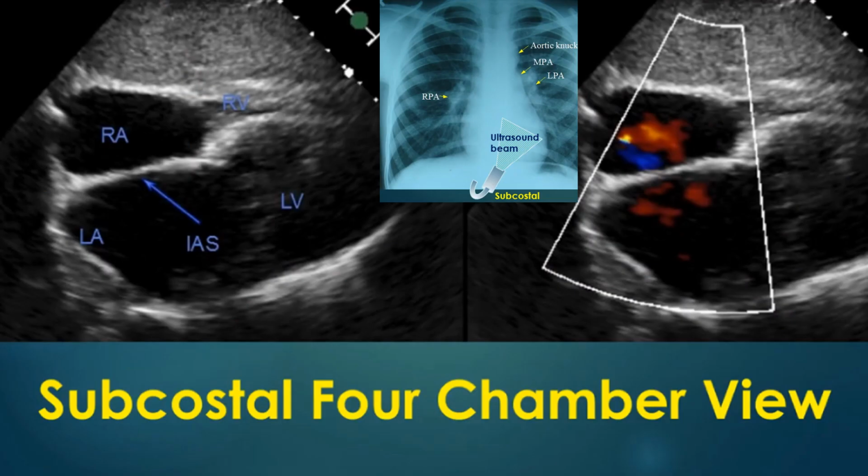Subcostal 4-chamber view is excellent for the visualization of the interatrial septum. Subcostal 4-chamber view shows right atrium, right ventricle and the left ventricle. The central portion of the interatrial septum is thinner than the rest of it and represents the fossa ovalis region.